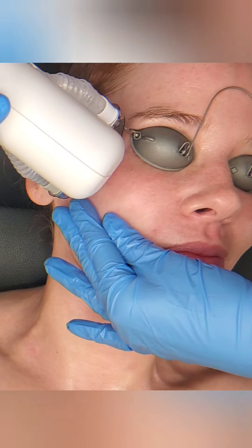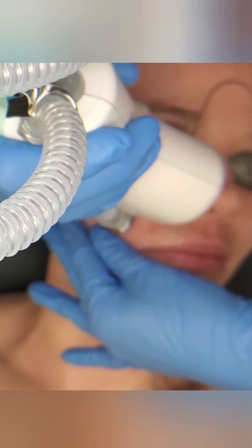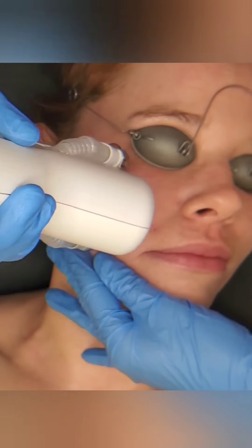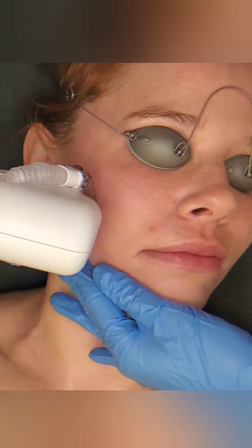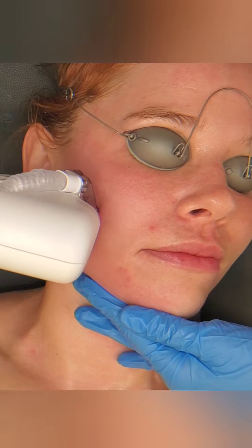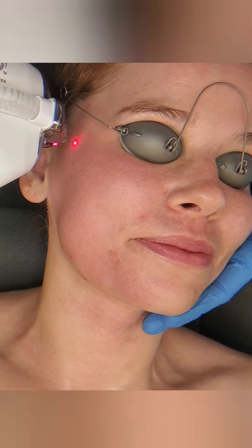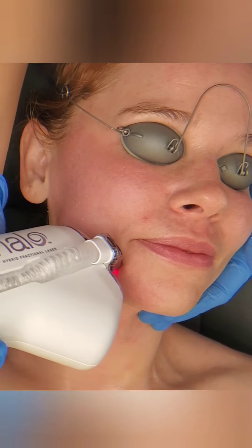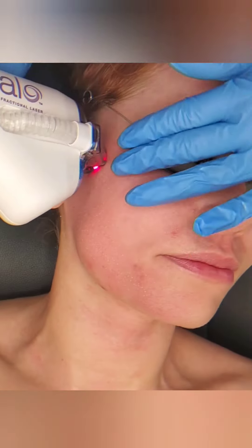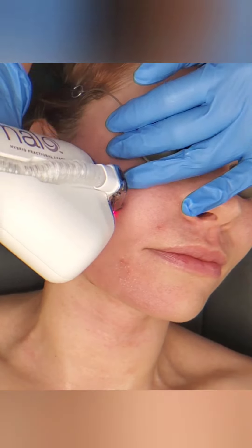Halo is the only laser in the world that is a hybrid laser — it has two lasers working at the exact same time together. One of the lasers is focused on the top layer of skin known as the epidermis, which is made up of several layers. The other laser is going deeper into the dermis where the collagen is formed — that's what builds stronger elastin, keeps your skin from sagging, targets deep wrinkles, and targets deep acne scarring. So it is a fabulous tool.